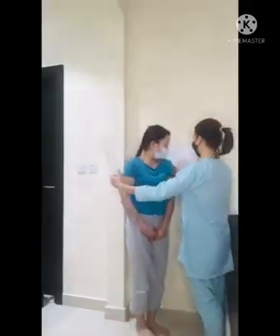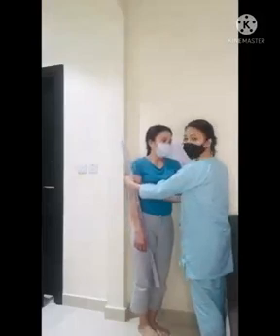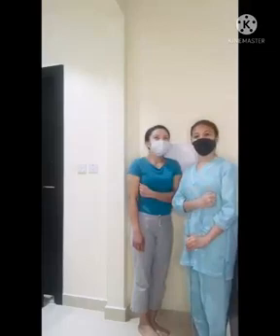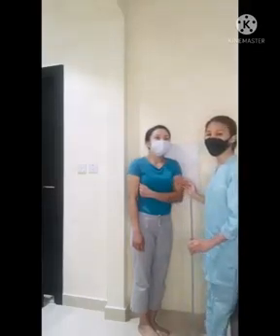So, the patient is upright, 45 degrees body rotation, elbow is flexed. So, the hand is placed across the chest region in pronation. Para po siyang ganito po yung position. So, tama po yung position ng pasyente natin.